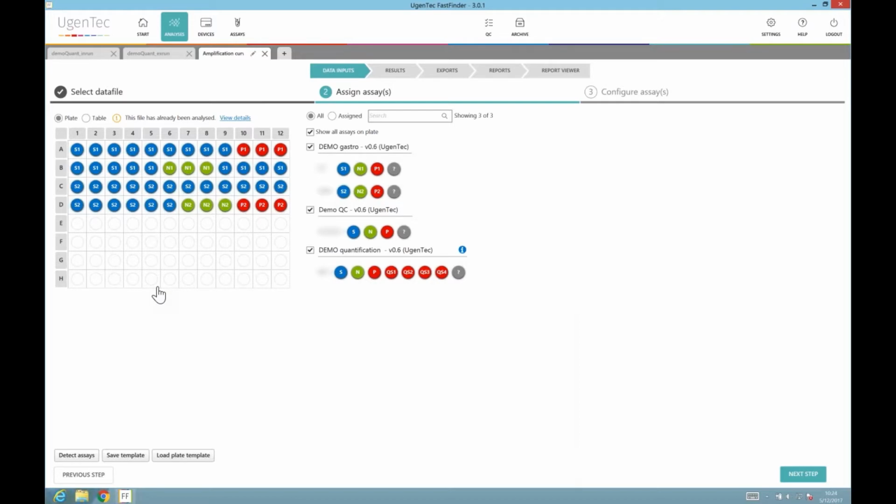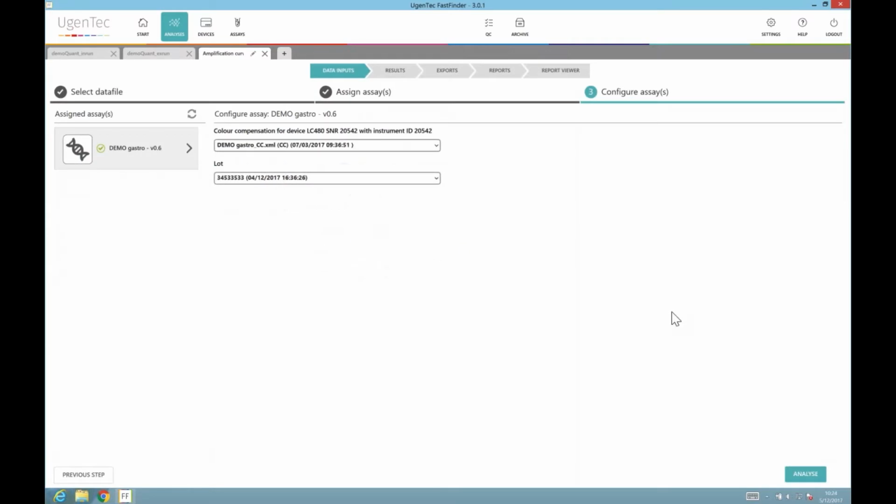And in terms of the decision tree, this is again all automated in the assay. So if there is something contingent upon 2 different wells for the same sample, all of that decision making is again automated within the decision tree, leading to a combined result.